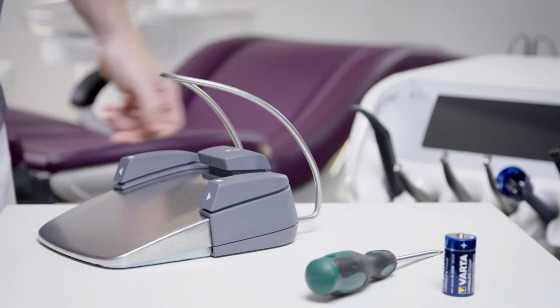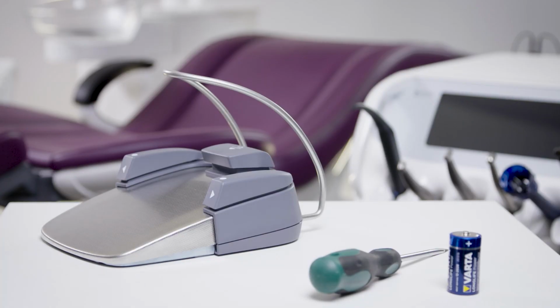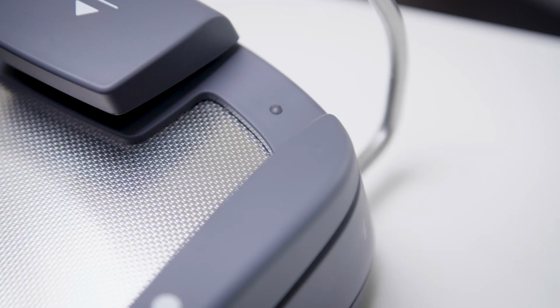If the yellow LED lights up for approximately 10 seconds directly after insertion, the battery is okay. If the LED flashes after insertion, the battery is too weak. If it does not light up at all, the battery is empty or unsuitable for use.